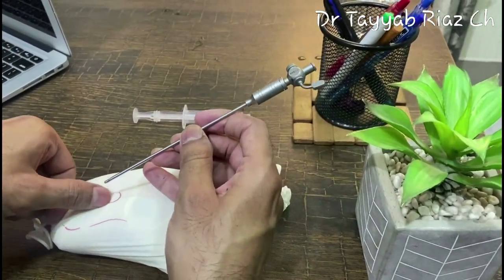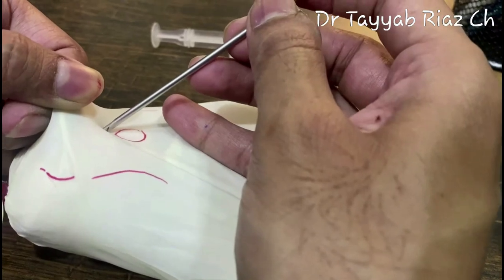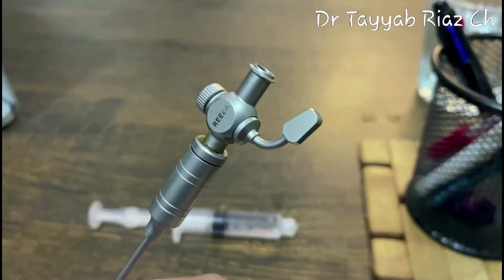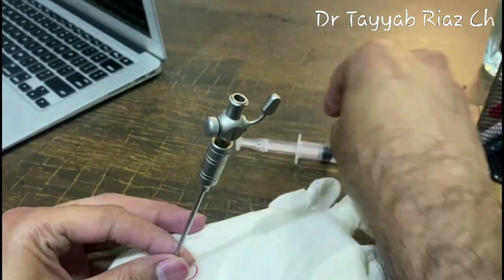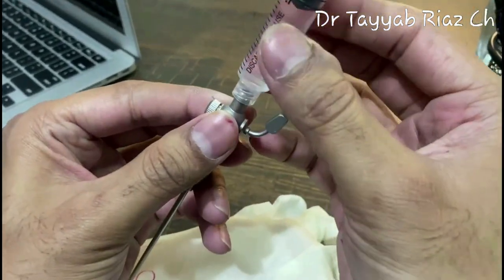Now suppose we are going to insert our needle into the abdominal wall, knowing all the principles of entry that I have already told, and after slight force you just heard one click sound and also observed first uplifting then release of the safety spring of the stylet. It means we have crossed the rectus sheath, but still we are in the preperitoneal space. Now I will perform the confirmation test.